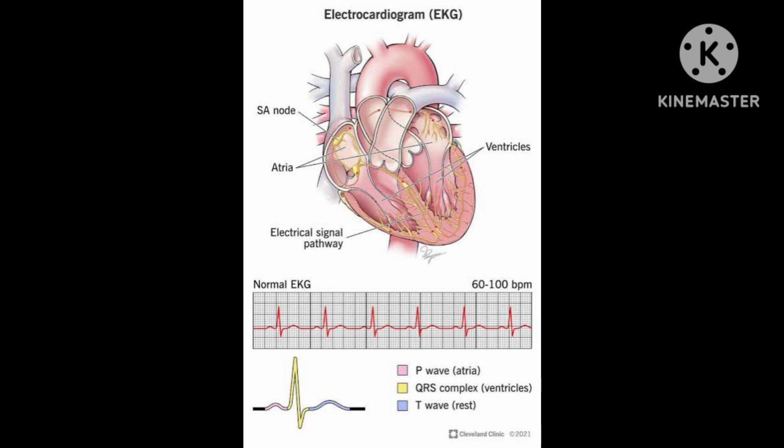And also another use: an ECG also helps to determine the location and amount of injury caused by a heart attack, and later helps to assess the extent of recovery. The ECG is very useful in this way.